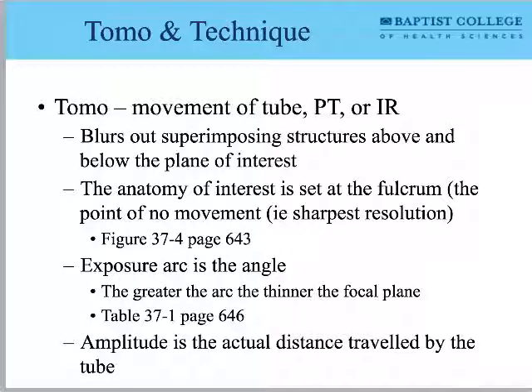So by doing a simple measurement on the patient's side, using calipers or one of these, you could estimate the plane in which the kidneys are lying and blur everything else out. So all I see is the plane where the kidneys live. I don't see any other plane, just the plane where the kidneys live, not airplane.